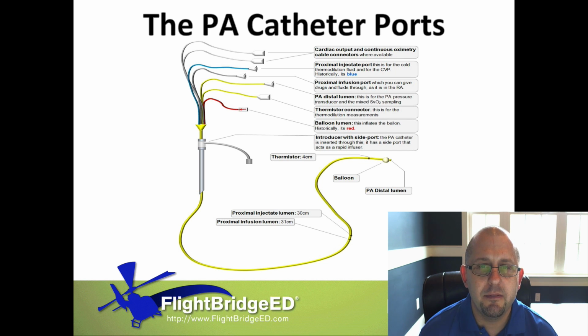So I think it's very specific to a disease process. They're used, obviously, in open heart surgeries. They're used a lot in sepsis. But even specific physicians around the country, around the world, are starting to get away from using a Swan because they've shown that there's no improvement. There's no increase in patient survival. So morbidity and mortality has not been improved by placing a PA catheter or a Swan.